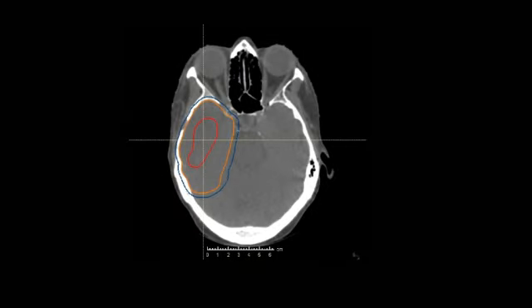So here we go. In the last video, we talked about the volumes, so GTV red, CTV orange, PTV blue here. Let me talk about some of the limitations of that type of approach, because there are some. For example, in a plan, I might have a cold spot in this part of the anatomy. Or I might have another plan where I have a cold spot in a different region, like here. Both of these plans would look the same. They'd have the same DVH. But I think you can agree biologically those would probably not be the same. They'd have a different impact.